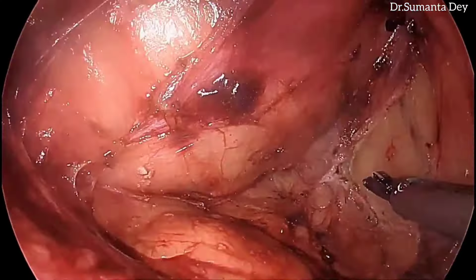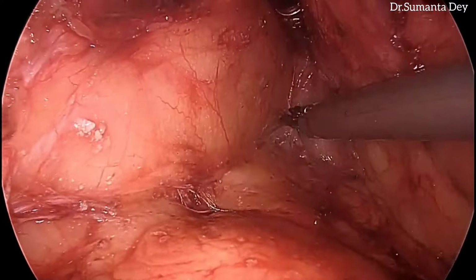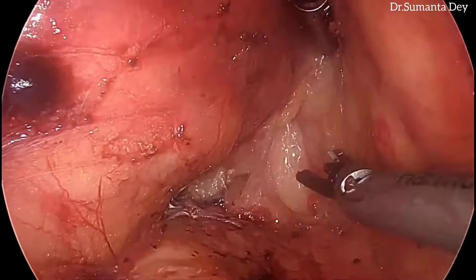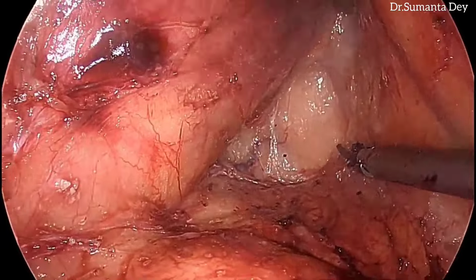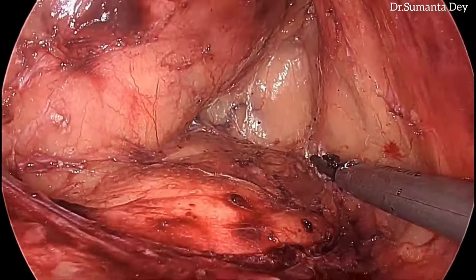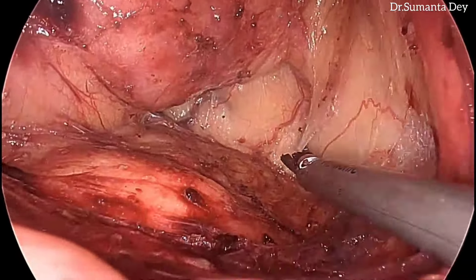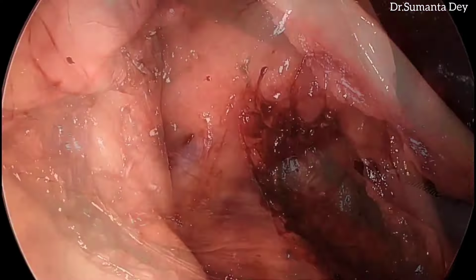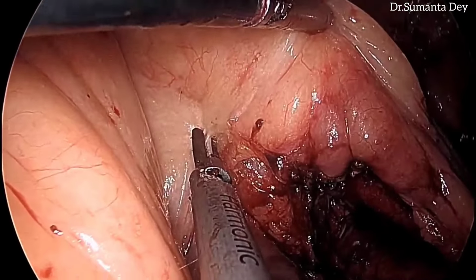Then, following the same plane, dividing the white line of Toldt, we gradually go up till the point where we have completed the dissection, and then we can see the wall of the left colon. That means the medial to lateral dissection has been done. This is one important part of splenic flexure mobilization, because this CME dissection will help in mobilizing the left colon just distal to the splenic flexure.